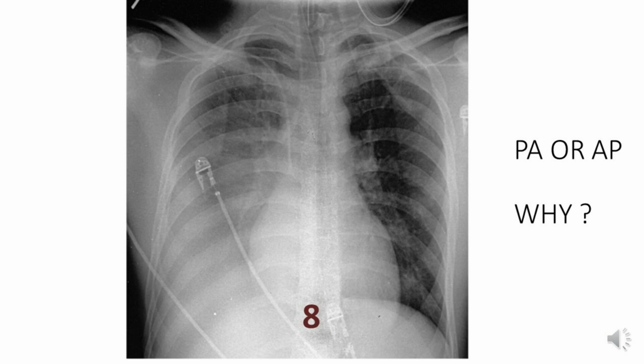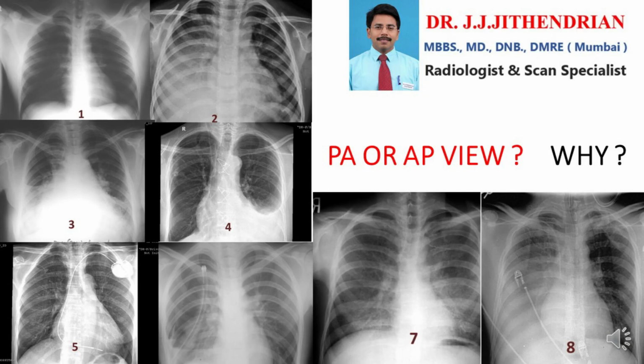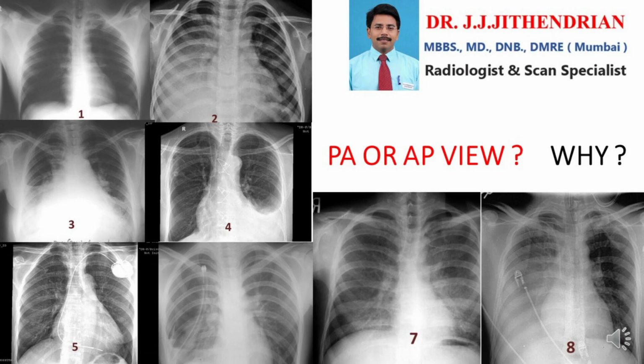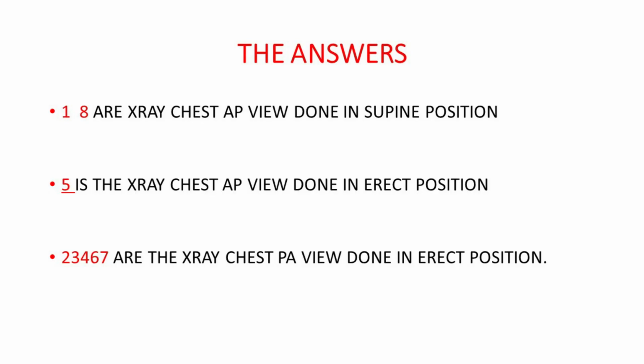I have given the images for only a few seconds, and if you want more time, please pause the video and go back to see the images again and reassess. This quiz is not only for radiologists but also for undergraduates and postgraduates, and also for consultants like physicians, surgeons, anesthetists, and some of the super specialties who are all dealing with X-ray chest every day. Now I am going to give the answer, and if you are 8 out of 8, you can quit the video right now because you know what I am going to talk and you are very great. Now I will tell the answers.